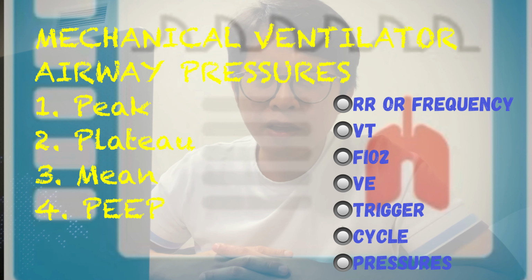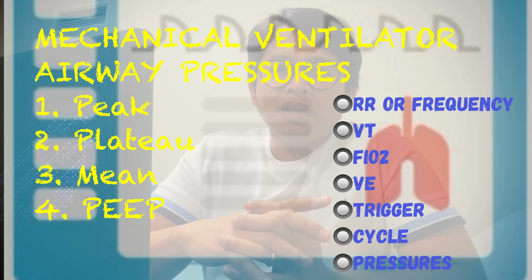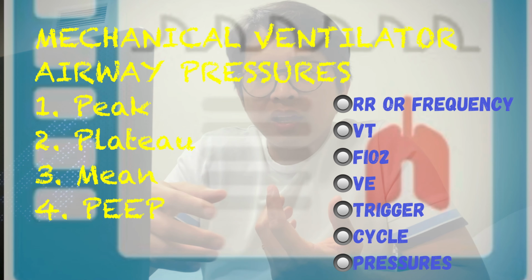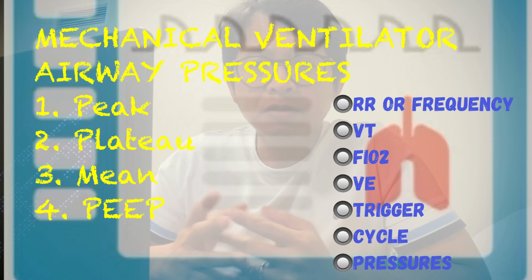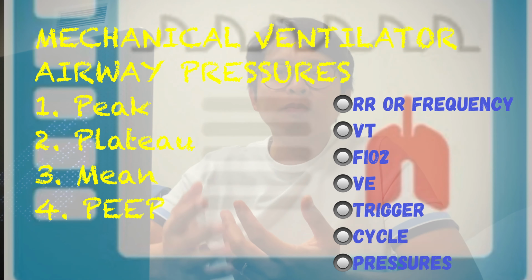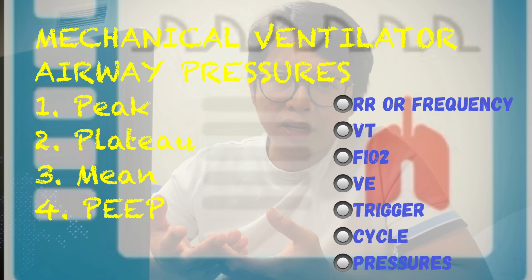How about mean pressure? Your mean airway pressure is the average pressure your lungs are exposed to during mechanical ventilation, both during inspiration and expiration. The average of all pressure during the breath cycle is your mean airway pressure.